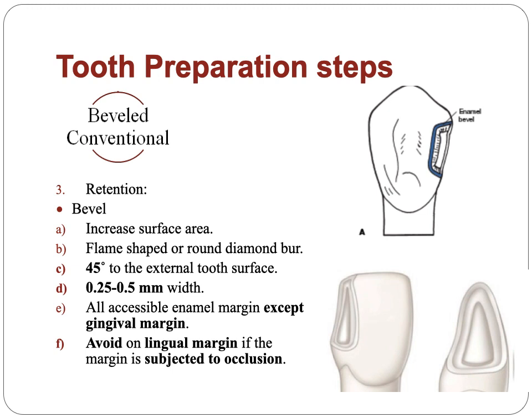That's why we say in the beginning, make your occlusal assessment. If there is a contact on the margins of your cavity, it's better not to place a bevel, because the area of the bevel will have a thinner part of the composite restoration, and with occlusion it will fracture afterward. So don't place a bevel if you have occlusion on the lingual surface.